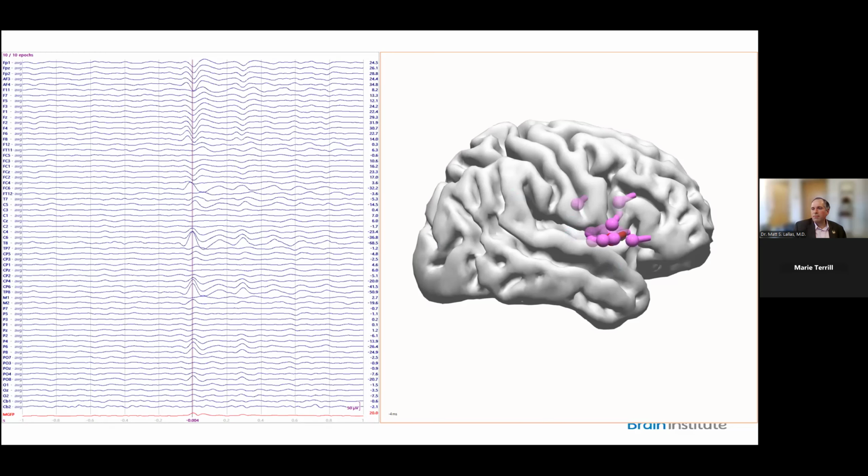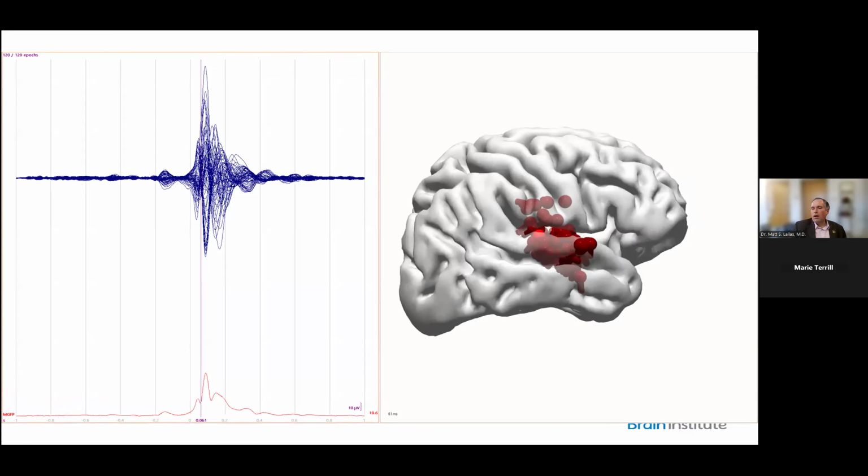And now I'm looking at the same thing, where it's the spikes that explain 60% of the signal, but at the peak. And more of them have been able to stick around because, again, our signal to noise is higher. But I'm trading the fact that I may be looking at an area where I'm getting a later cortical involvement. This was the same thing, essentially, but I found a higher amplitude spike to serve as the basis of my template match. And in the end, I ended up with 120 spikes. And that was with a really high level of agreement across the spikes.